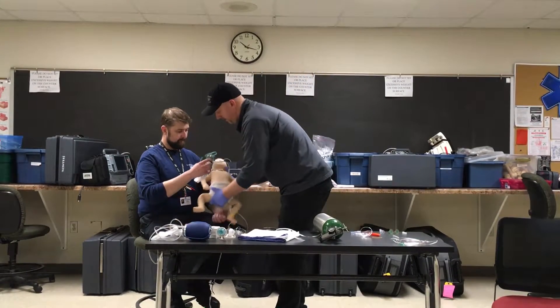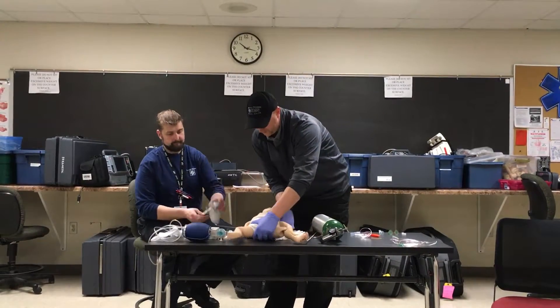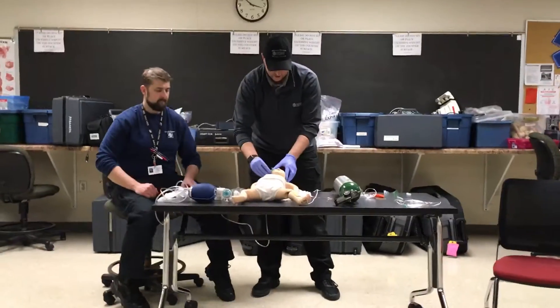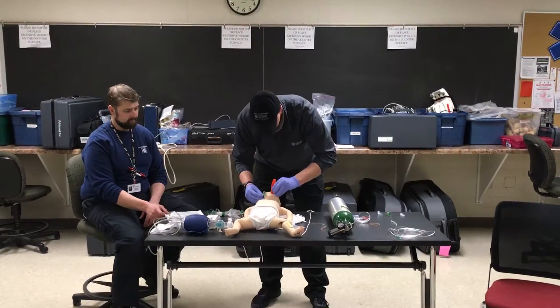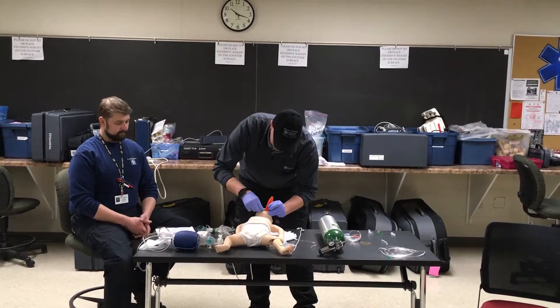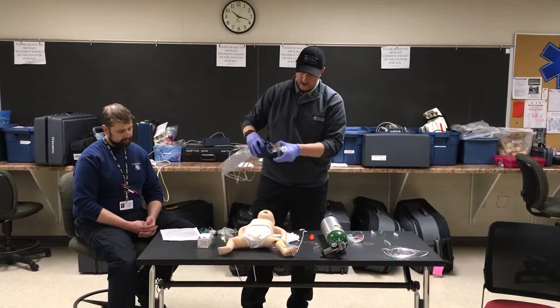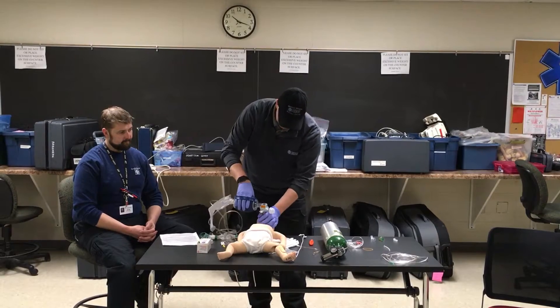I'm going to take the infant from dad and place the infant down on the table. At this point, I'll measure and consider the insertion of an airway — we'll measure then insert using a tongue depressor. Make sure you hook that tongue, then insert the oral airway. Now try to ventilate. The evaluator should tell us that we inserted it correctly and the patient does not have a gag reflex.